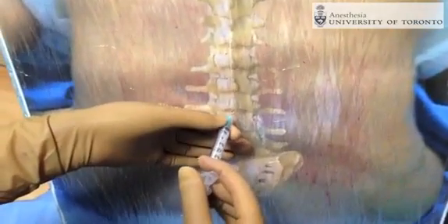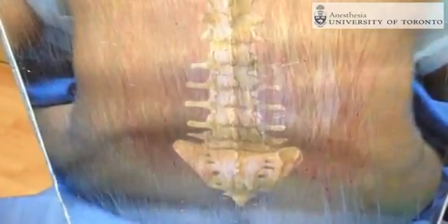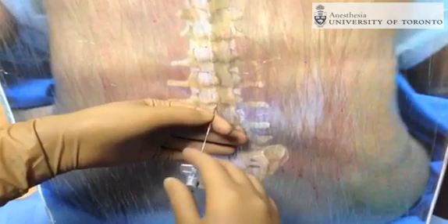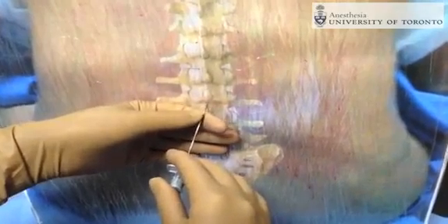A small amount of local anesthetic is injected into the skin and a wheal is created on the patient's skin to produce local anesthesia over the site where the epidural needle is going to be placed. Once the local anesthetic is injected, the epidural needle is then placed in the L2-3 interspace.